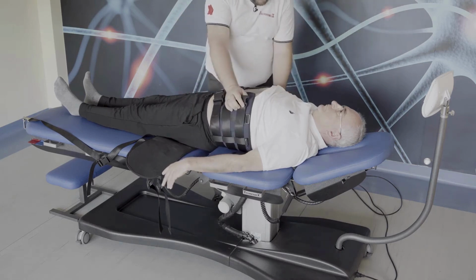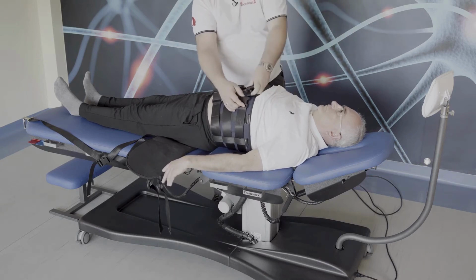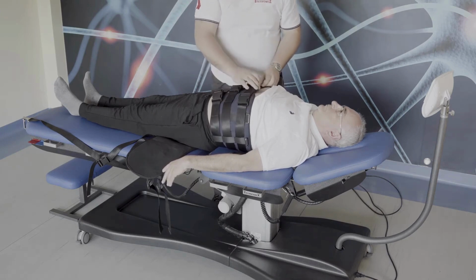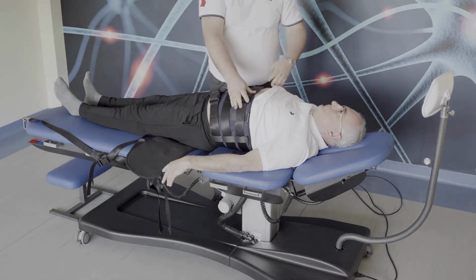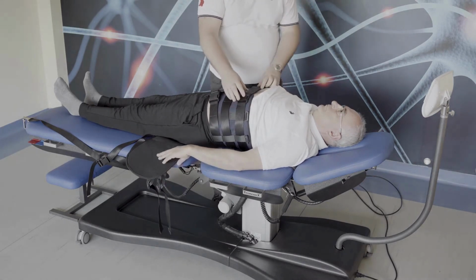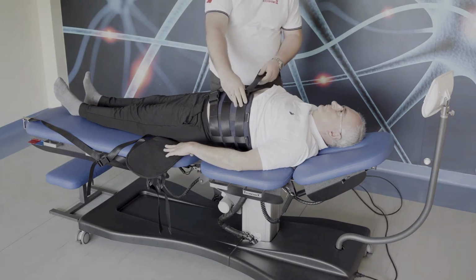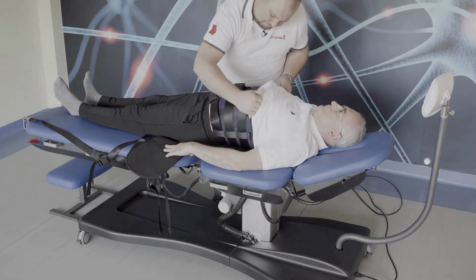So we close the thoracic belt. If the patient is smaller and the thoracic belt, especially in women, goes on the breasts, it's not needed to close the third, uppermost strip tight.